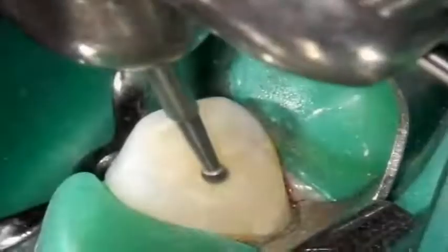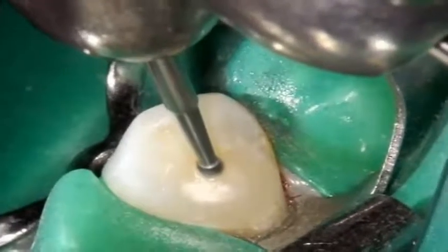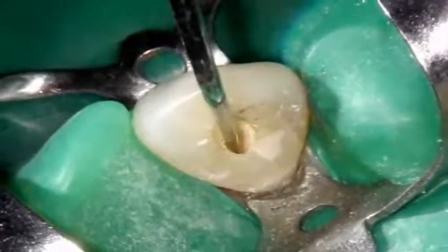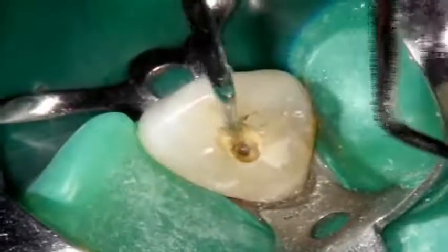Test cavity. After careful explanation of the nature of the test to the patient, preparation without anesthesia is done with a small and sharp burr. If the pulp is vital, there will be a sudden sensation of pain when the dentin is reached. In contrast, if discomfort or pain is absent, the pulp is probably necrotic.